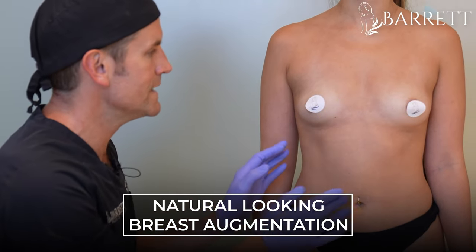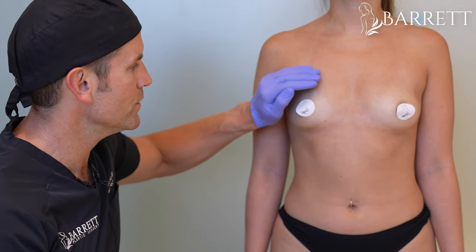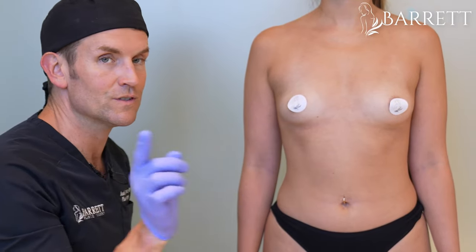Our patient is 28 years old. Today we're going to do a nice natural looking augmentation for her. She has a little bit of deficit right here, so we're going to fill that in and give her definitely more cleavage. We're going to do it all through the border of the areola incision, so stay tuned.